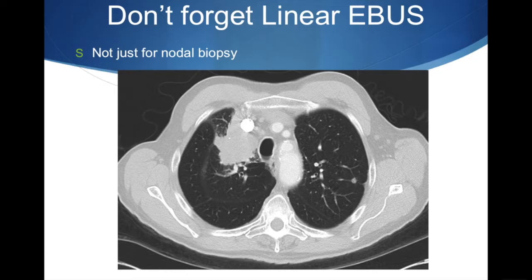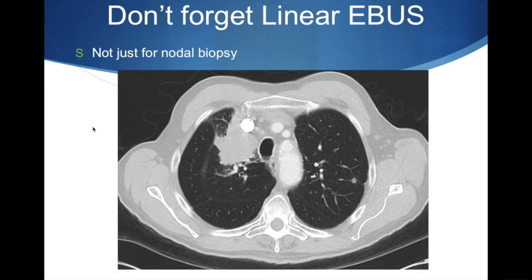Don't forget linear EBUS because it's not just for nodal biopsies. Here is a situation where we have a lung mass that is in direct contact with the trachea. So we can sit our linear EBUS scope here and put the ultrasound against the trachea, see that mass, and needle it through the trachea. That's a really easy way to biopsy rather than a CT-guided biopsy that has to come across lung, pleura, and fissure, or trying to navigate to that lesion with radial EBUS. So this is a great case for linear EBUS.